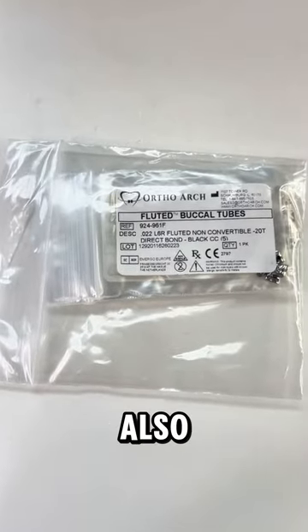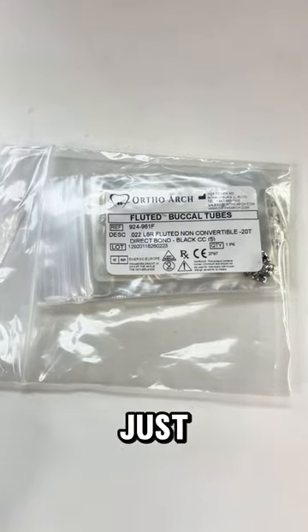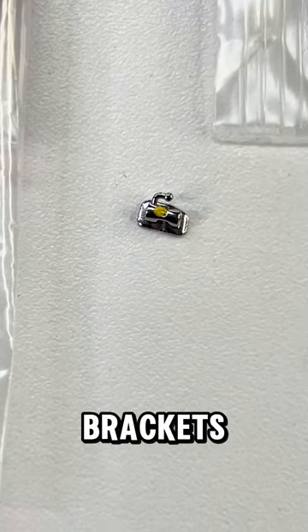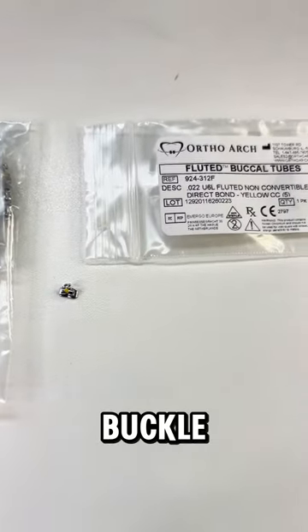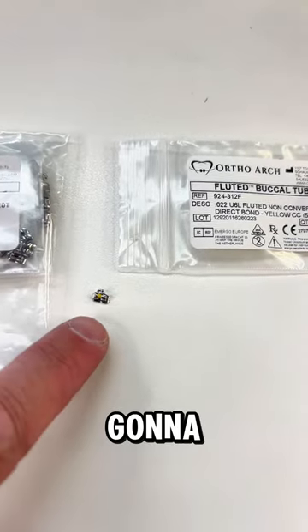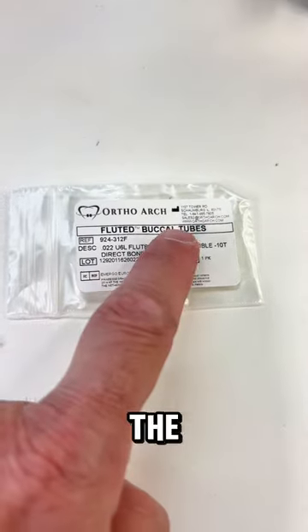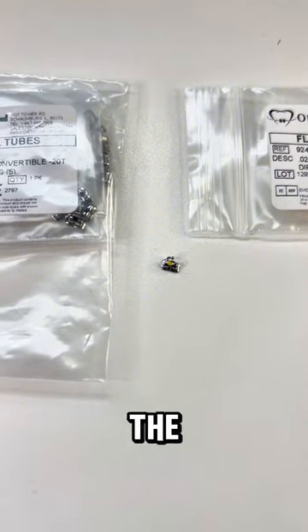You are also going to need some molar buccal tubes — this is so that we can practice not just banding, but also placing buccal tubes. They're tiny little buccal tubes that almost look like brackets that go on the molars. Get buccal tubes for all of the first molars — you will need four total, two for the lower molars and two for the upper molars.